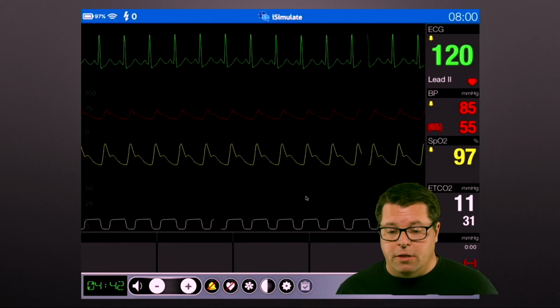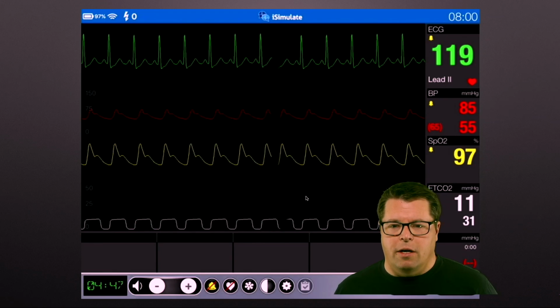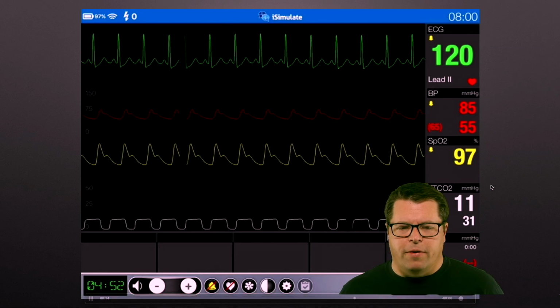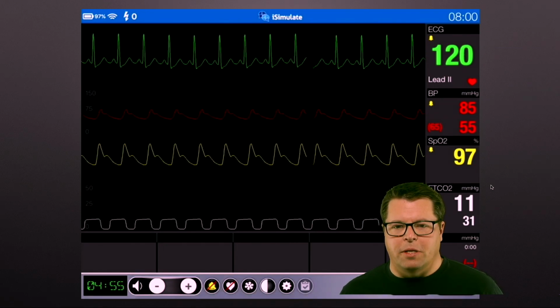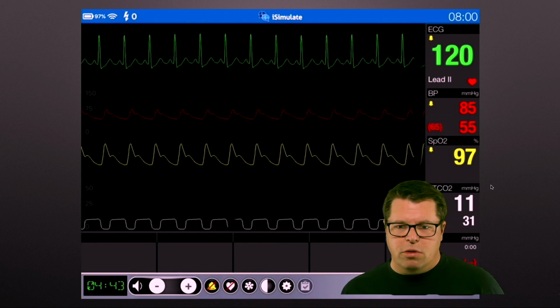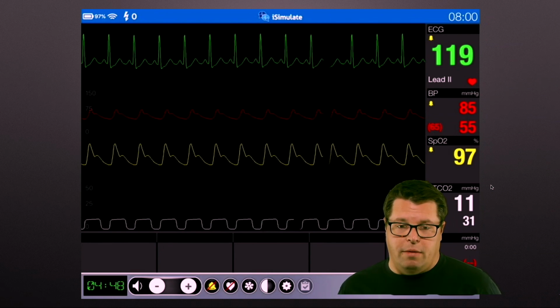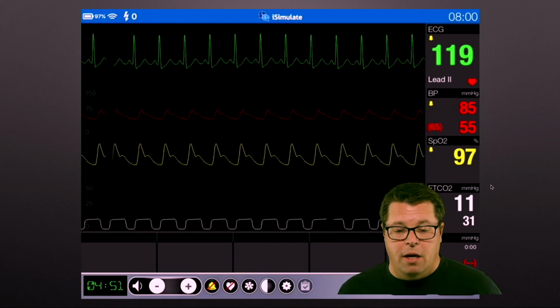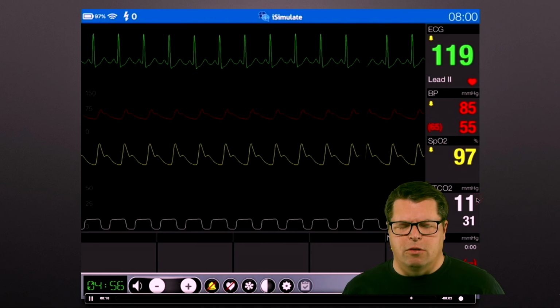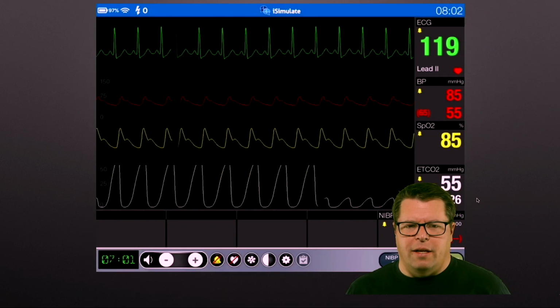Similar sort of patient here. You notice that the patient is hypotensive, again a little soft, tachycardic, low end tidal CO2, high respiratory rate, sats okay. We'll say the finger stick's okay on this one, but she's coughing up a bunch of yellow junk. What do we think about it? Well, she's got a fever. This is probably somebody who's septic and maybe in shock. All the parameters line up for it. Sepsis would be a reasonable thing to suspect based on this, and you might not be able to tell that without your end tidal CO2. Actually, there's probably a good chance that you already figured that out, but let's just say that it is something else you could do.